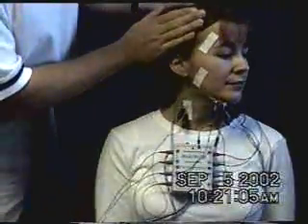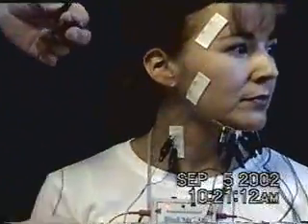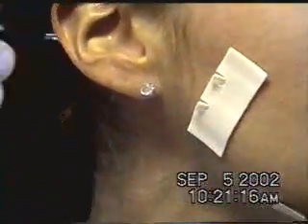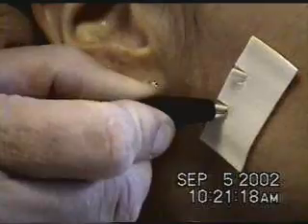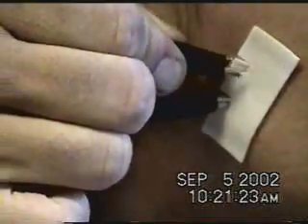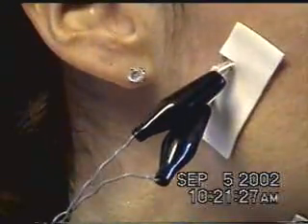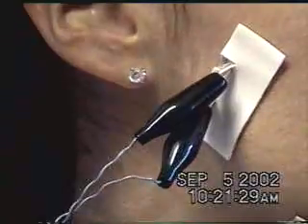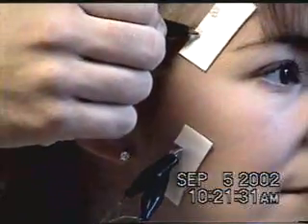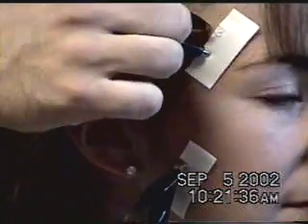We turn the patient just a little bit like this. You can see that as I go to attach the masseter electrode, I just take the two alligator clips that plug into channel 2 here, the medial masseter, and I'm going to clip one alligator clip to each of the tabs, just opening up the alligator clip, sliding it underneath the tab, and letting it close. I'll do the same thing for the temporalis, sliding the electrode underneath the tab and letting it close.